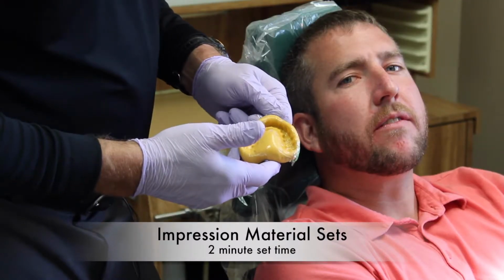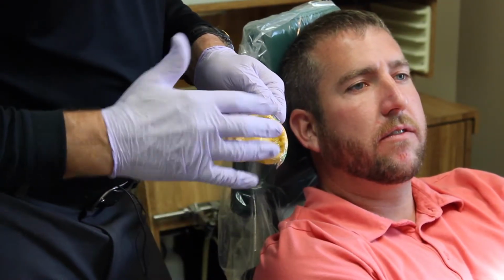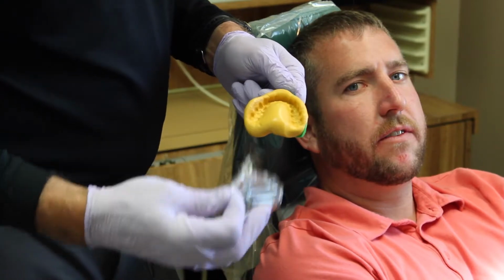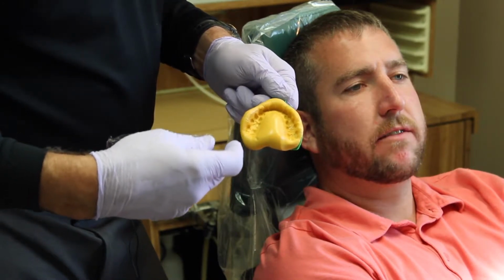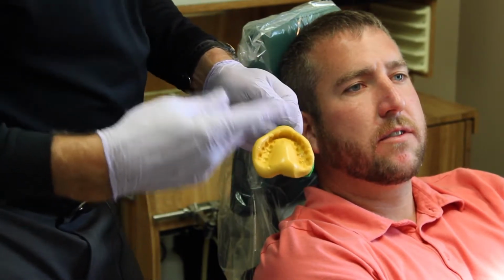Good. Now what you can see here is we've got an excellent impression. Looks like a very nice impression. A little muddled looking, a little unclear in some areas, and that's because of this separating material layer. If I remove that, what I've got here is an excellent custom tray. And I can fill that tray with a light body material, take a wash, and have an exquisite detailed impression. Watch this.